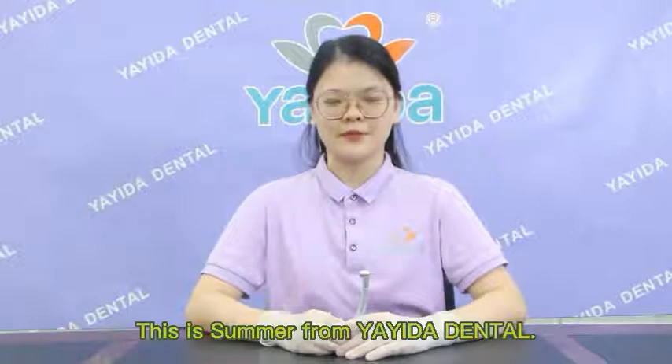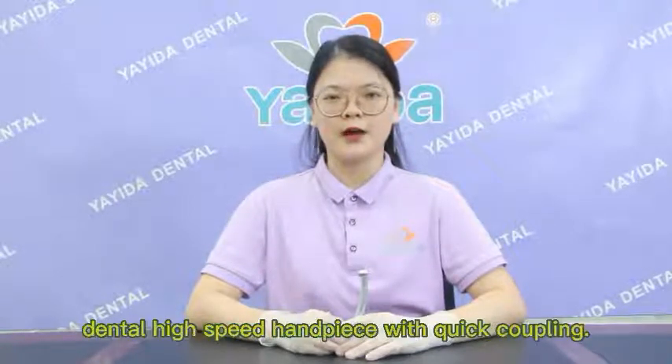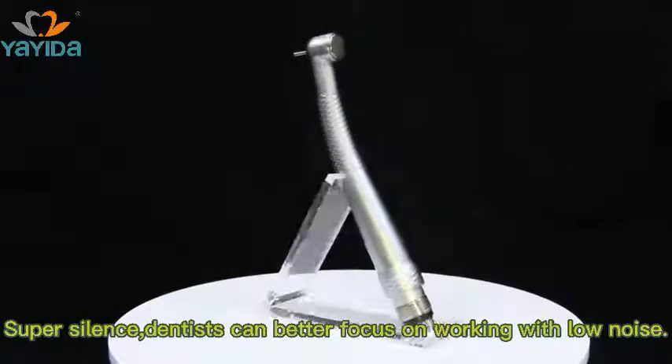Hello my friends, this is Soma from Diamond Dental. Today let me introduce to you a type of dental high-speed handpiece. Super silenced — dentists can better focus on working with low noise.